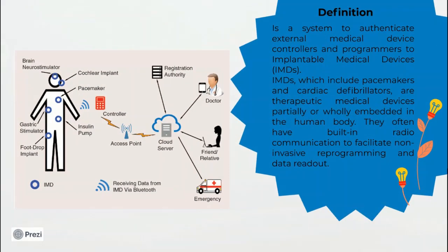Definition: a system to authenticate external medical device controllers and programmers to implantable medical devices. IMDs, which include pacemakers and cardiac defibrillators, are therapeutic medical devices partially or wholly embedded in the human body. They often have radio communication to facilitate non-invasive reprogramming and data readout.